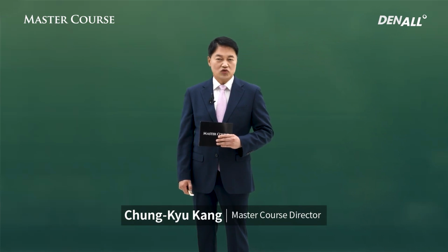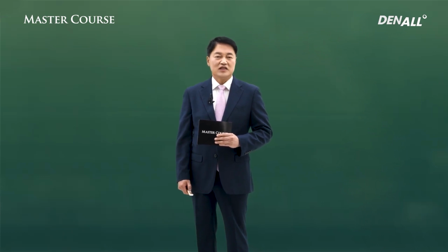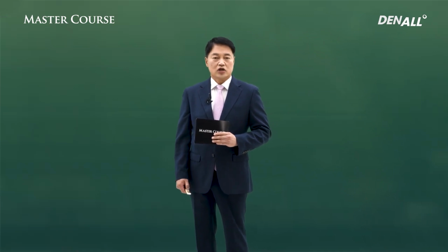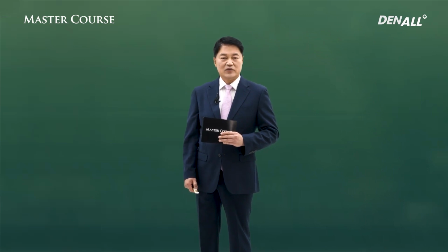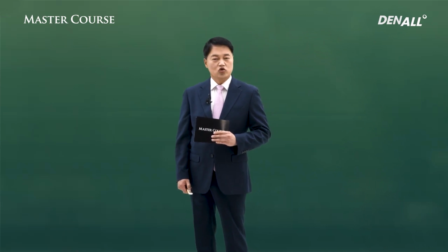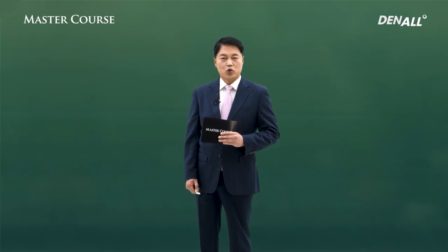When you do implant surgery, in more cases, rather than having a lot of bone, there's a lack of bone due to various types of bone loss, and you need to place implants even in those situations. In order to place an implant which is successful and has good prognosis, you need to conduct GBR. In this lecture, I'm going to talk about what needs to be considered for successful GBR, and I'm going to talk about bone graft as well as membrane.